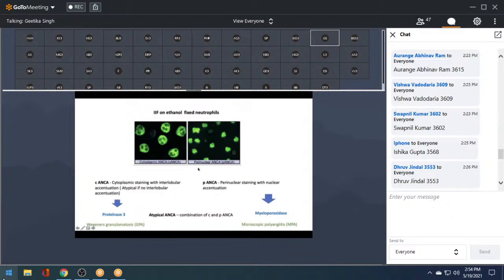Now, the second important antibody is the ANCA. Okay. So what we need to know about ANCA is we take a slide and we have a nice thin layer of spread out neutrophils, because that is the antigen that we're going to use to capture those antibodies onto the slide. And we will then stain and we will look at their pattern.